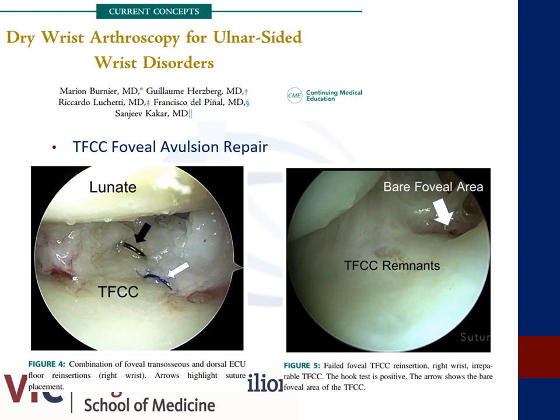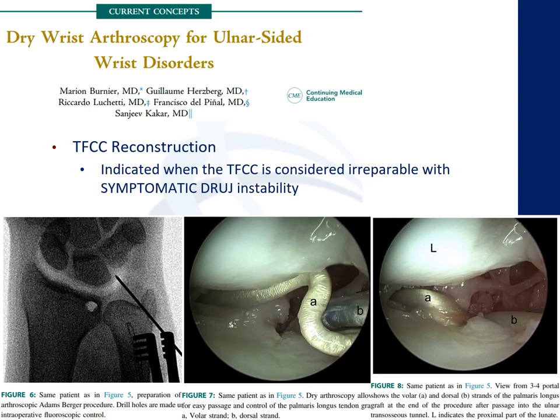The images below demonstrate a bare foveal area and the appearance following a TFCC repair. Finally, TFCC reconstruction is indicated when the TFCC is considered irreparable and there is the presence of symptomatic DRUJ instability. Dry wrist arthroscopy is more appropriate in the setting of TFCC reconstruction because there is a need for larger portals in order to pass the tendon graft. If one was utilizing wet arthroscopy, there would be concern for extravasation.